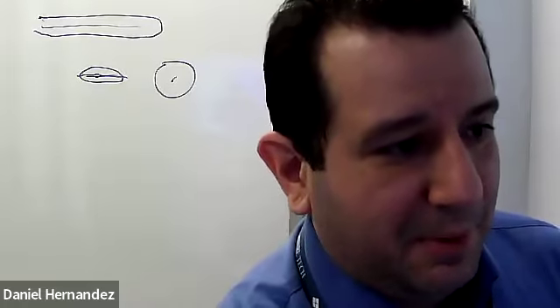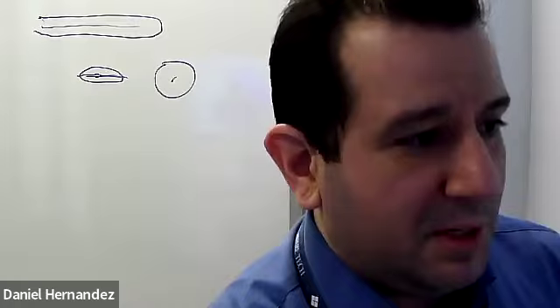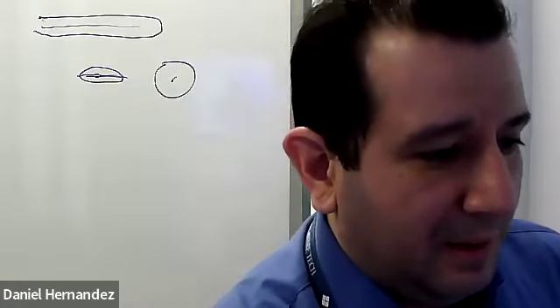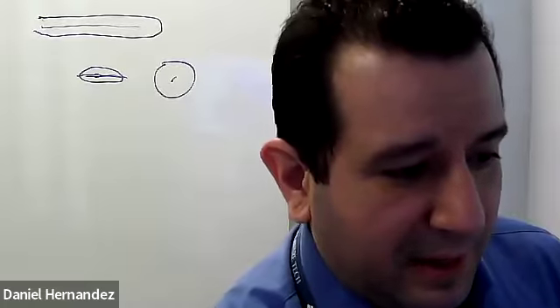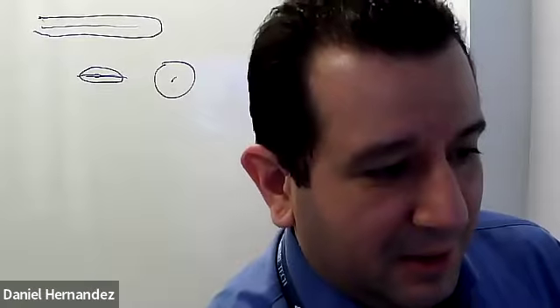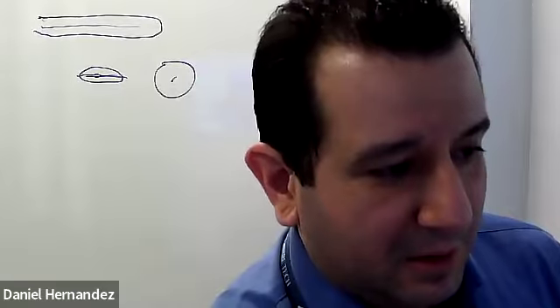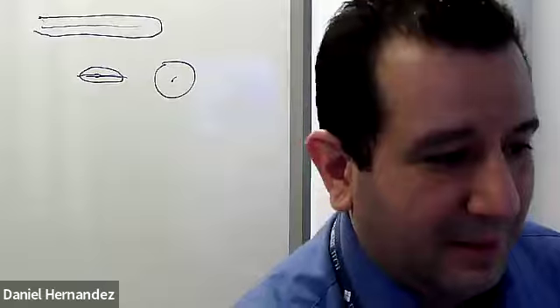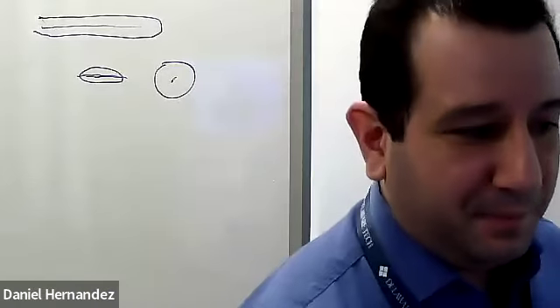So this is the distal tip. That's more medial, more central, then out lateral, where it connects back to the cecum. This was a good picture showing the appendix actually coming off the cecum. So what it looks like when we're looking for the base of the large intestine and then the appendix coming off. And we're lucky enough to have it draped over the iliac vessels right there. So that's nice.